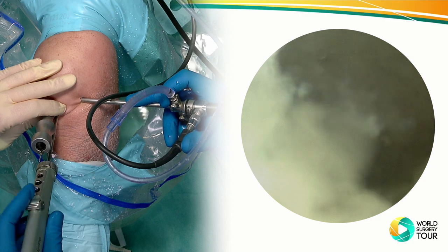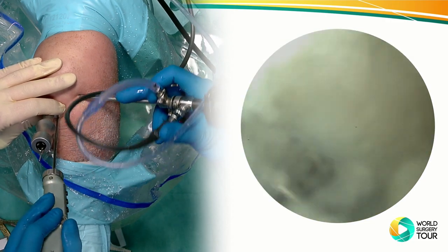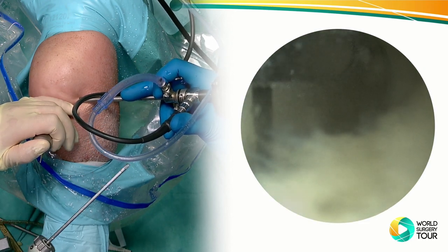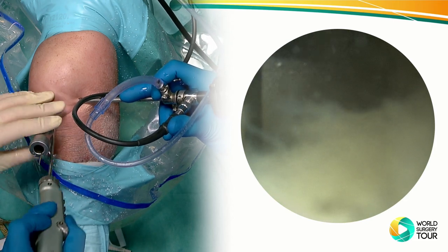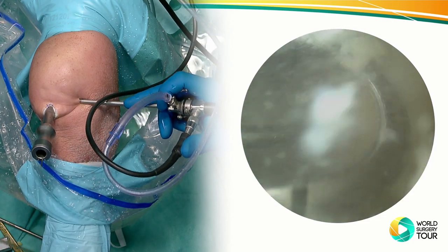Doesn't shave much. Is it working? It's working, it doesn't do much. Oh, it's stuck. It doesn't remove much. Okay, let's do the HF device.